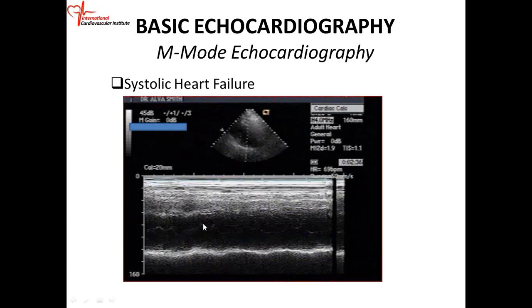We're interested in the mitral valve. You can see that the mitral valve opens right here. Mitral valve opens in diastole, closing in systole. Just look for your ECG. Okay, so everything means something. Look for your ECG. Mitral valve opens in diastole, closing in systole, opens in diastole, closing in systole. You can see the D point. D point is right there. E point is right there. F point, A point, C point. So this is normal opening.